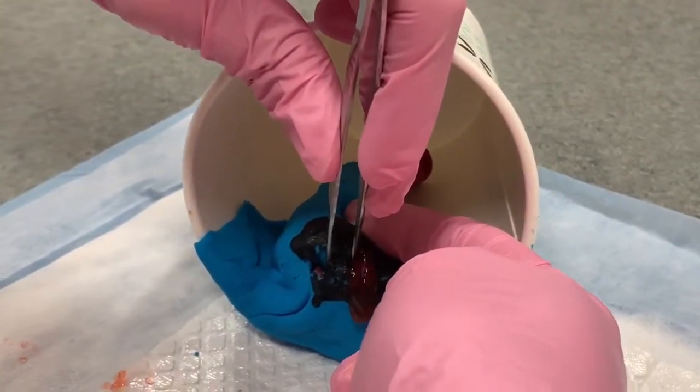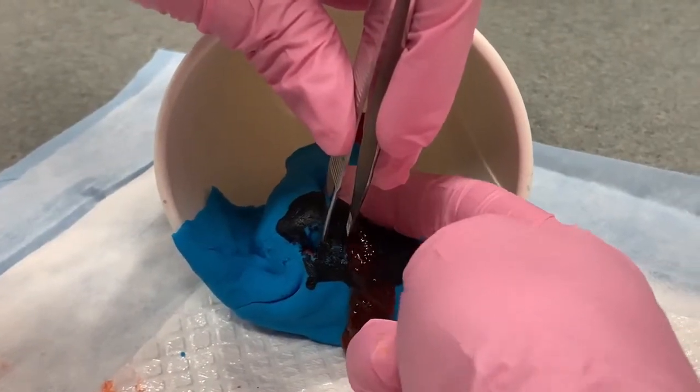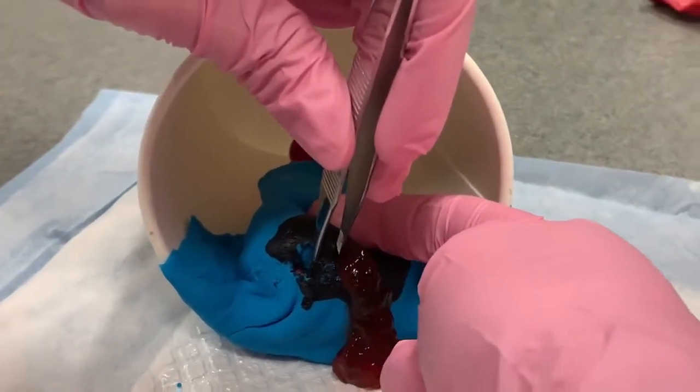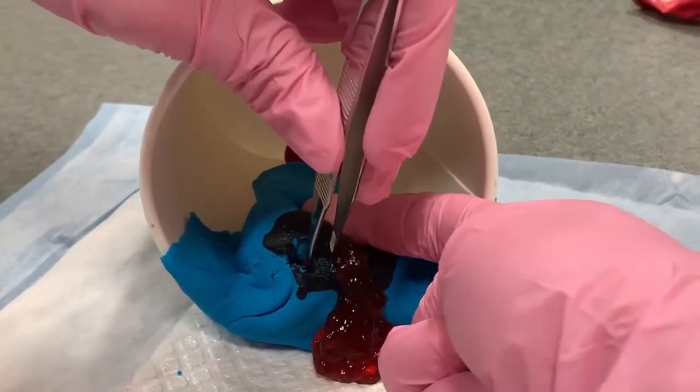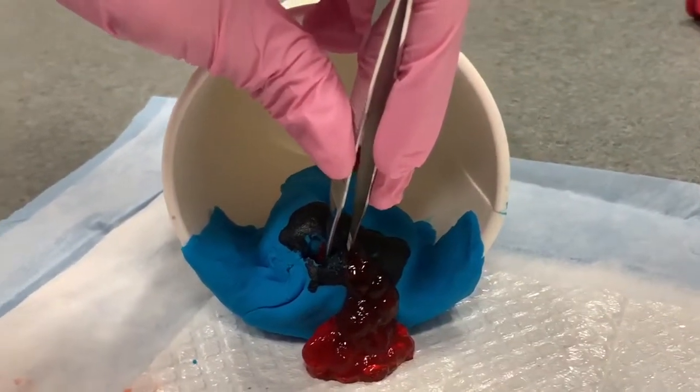We can express some of the contents of the cyst or abscess. You don't want to express the contents completely because you may lose the placement of the Word catheter.